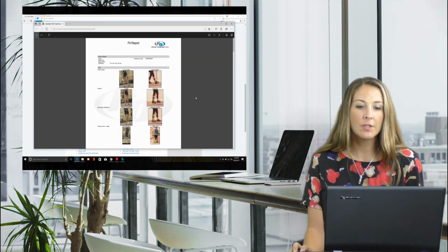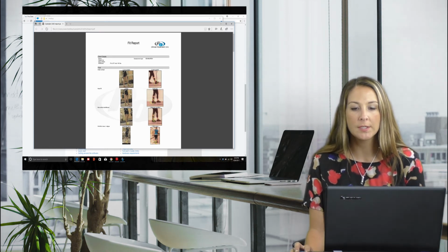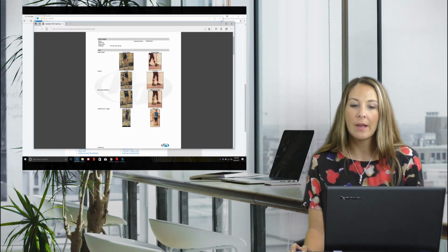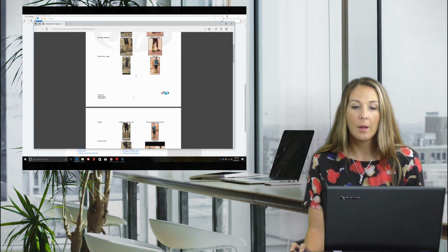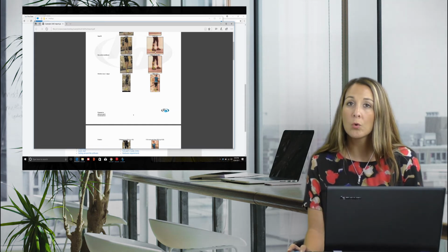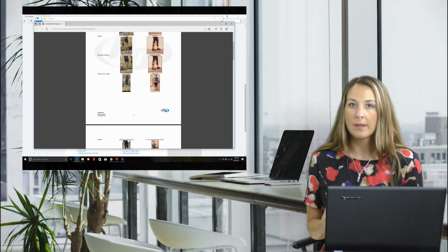Okay, so this report was done, it was an Edinburgh visual gait score, and this was an actual patient. And so as you can see, the images come up and it allows us to see why we made a clinical decision. So we've got the decision was toe contact for the initial contact pre-intervention, and now she has heel contact. Then we go to heel lift. We see a delayed heel lift because there's no heel lift at all, and now we've got a little bit more normal of a heel lift. So again, those images can tell the whole story in their entirety.